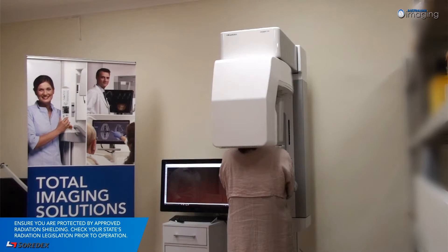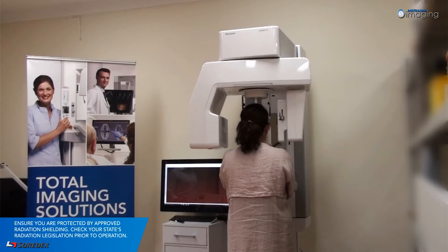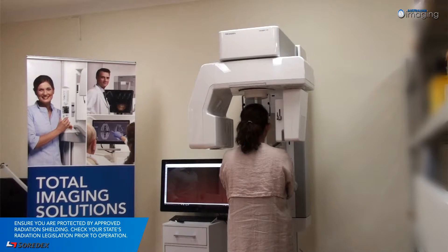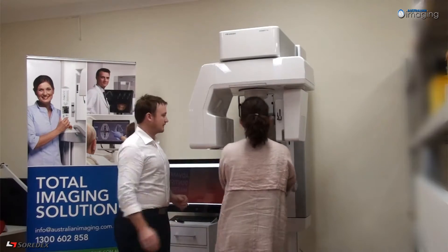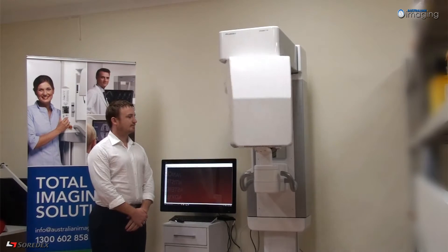The image has been taken once the machine has completed one full rotation and the beeping has stopped. Your image will automatically be available for analysis in Scenora. After the exposure has been taken, the unit will pause in the patient exit position. Release the patient from the machine and then press the return button to revert back to the start position.